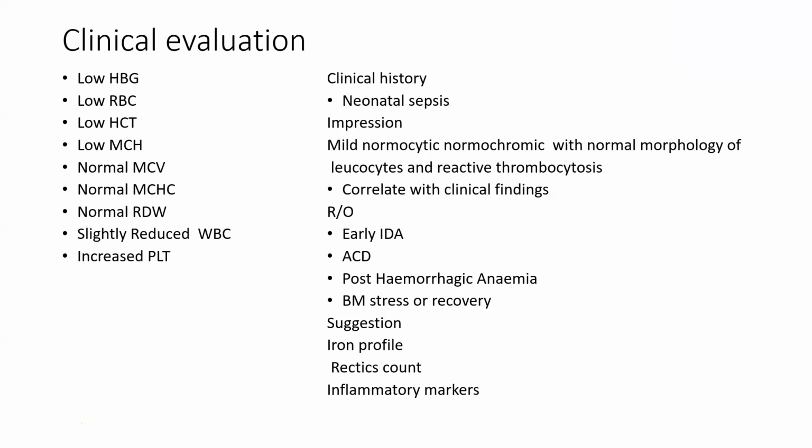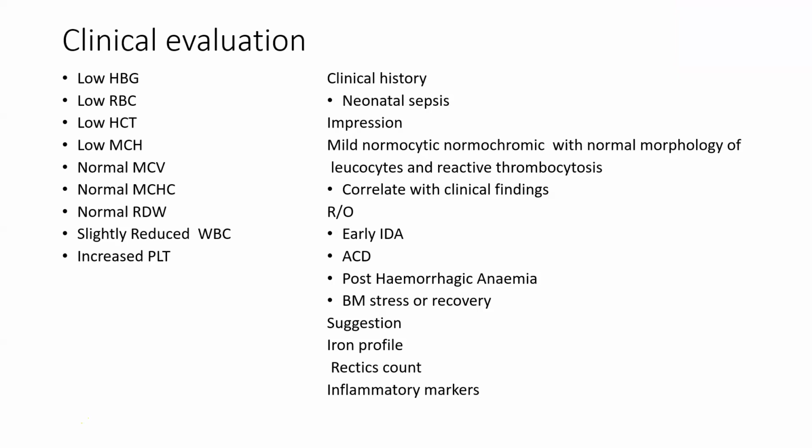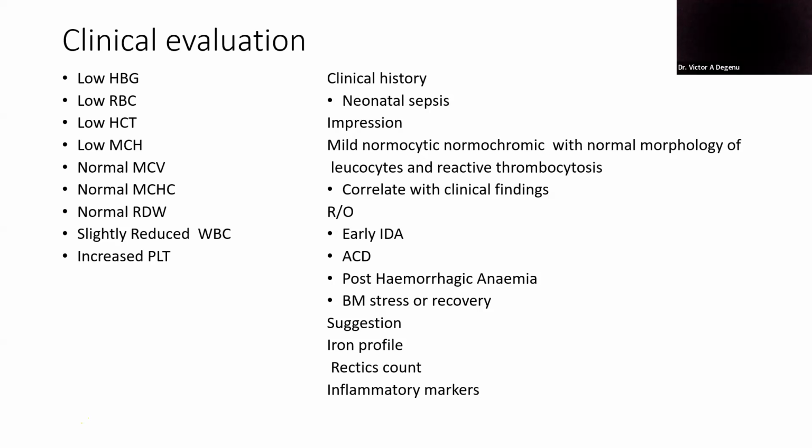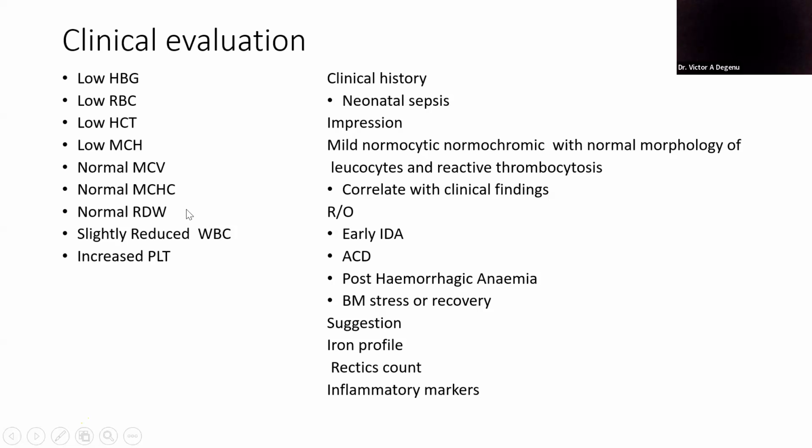So I was saying, if I were to interpret this, is it that the RBC count is reduced? It is low, the RBC count is low. So I was thinking maybe the MCH is slightly reduced, probably because the RBC is the denominator and it is reduced. And the RDW is normal, yet you still suspect early iron deficiency. Yes. So I wanted you to clarify that.